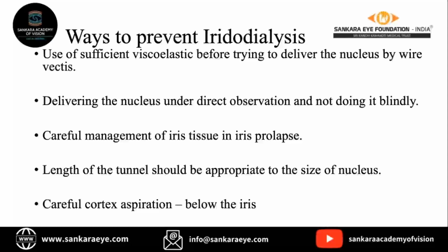And if there is iris prolapse, you have to manipulate it very carefully, and the length of the tunnel should be very appropriate depending on the size of the nucleus. Cortex aspiration should be very careful, especially when you are removing below the iris.